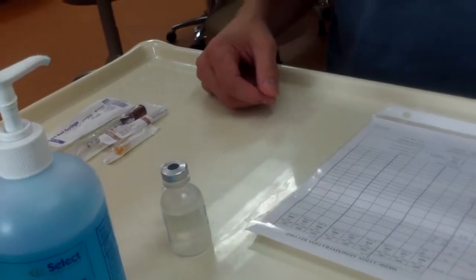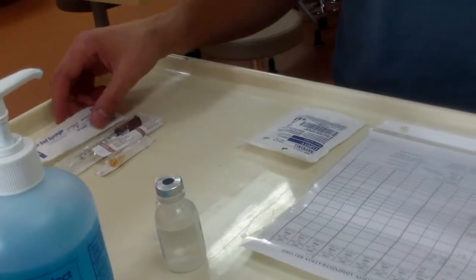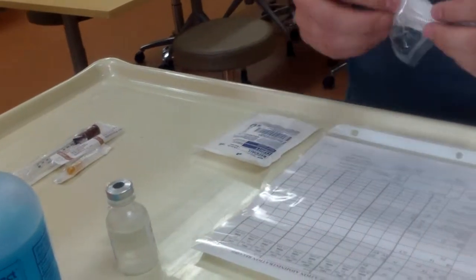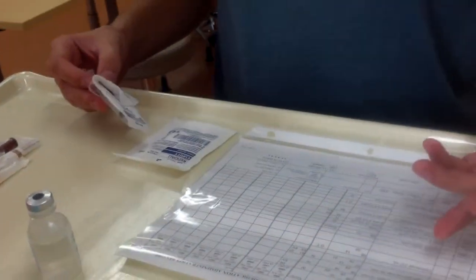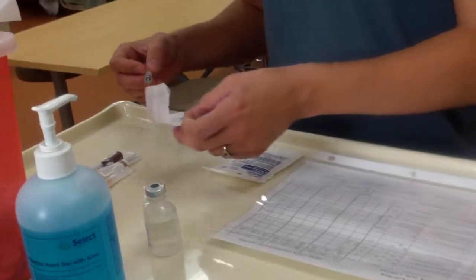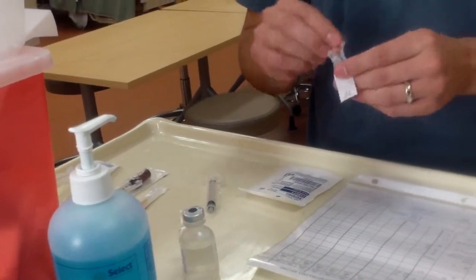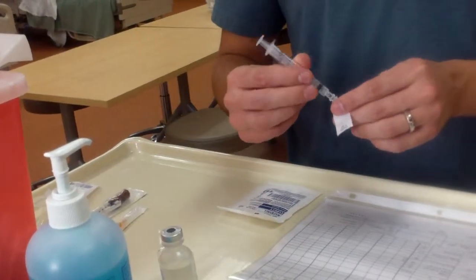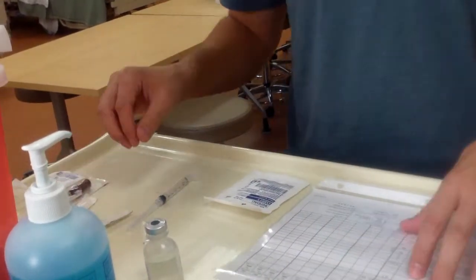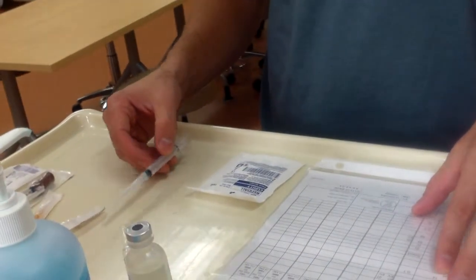So now I can do my second check, which is administering. First I'm going to do the ampule. So I have my 3 milliliter syringe. I've already done my appropriate drug dose calculations, making sure that they're in the safe dose range, because I don't want to harm my patient. And for an ampule, you'll need a filter needle. So I'm going to attach my filter needle. Get that ready. Okay, so I know the amount, which is half a milliliter with an ampule.